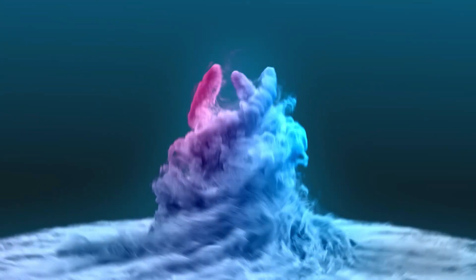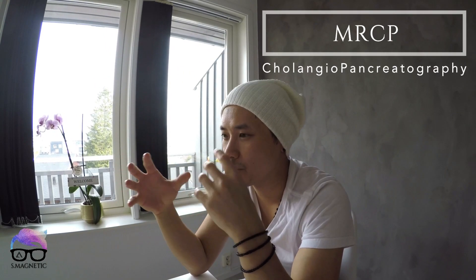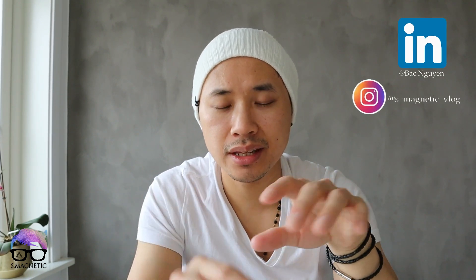Welcome back for another video on MRCP. Today I'm going to talk about MRCP, which is divided into two parts: imaging the bile duct system or the pancreatic duct. Today I'll show you how we plan the bile duct system, because the protocol is different for each. I'll show you how we perform this, share tips and tricks, and go deep into every detail so you can avoid pitfalls.